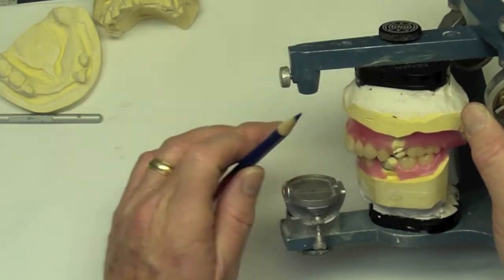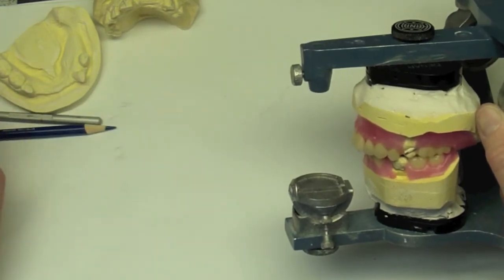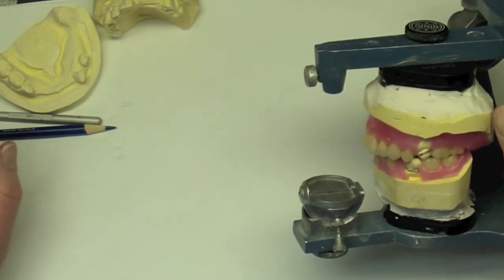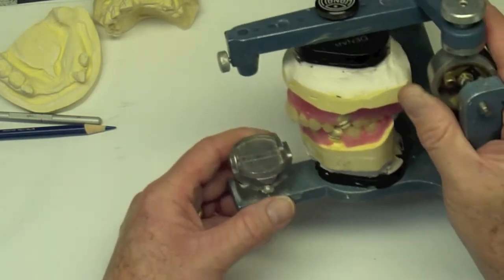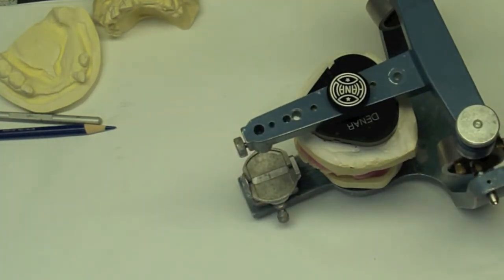This will be step one will allow healing and then step two will be to fabricate immediate complete dentures. So I'll go ahead and re-contour these and pop it back on again so you can see.